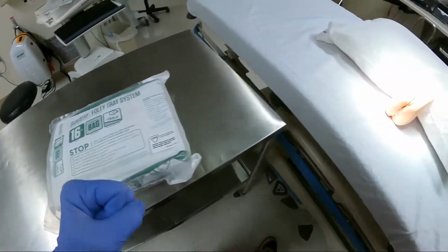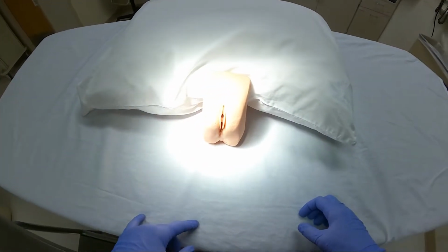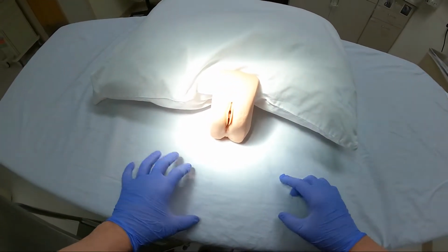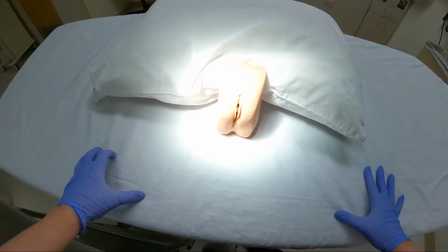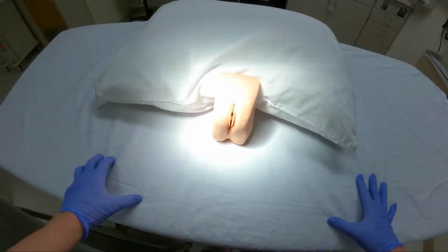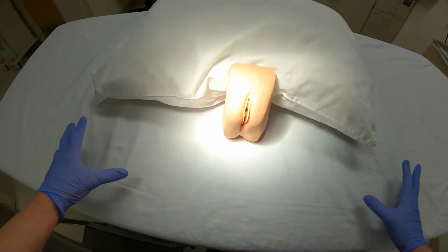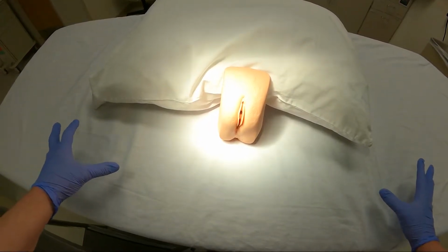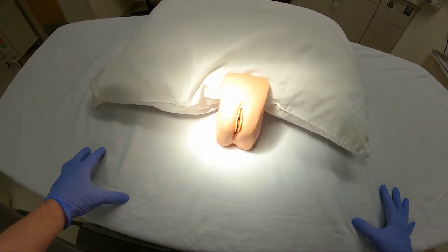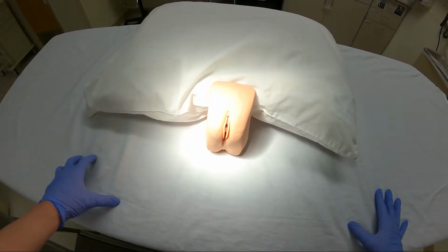So we're going to go ahead. This is our patient, and as you can see, we have a female patient that we're putting this in. Lighting, bed, all needs to be at an optimum angle so that you can do this correctly. If the patient has fecal material or yeast, is a large person, or looks like poor hygiene for whatever reason, you need to clean them up first.